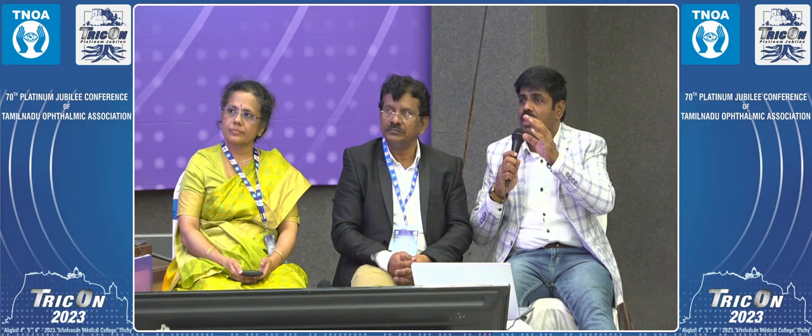Thank you, Professor Dr. Venkatesh. A quick question to you regarding the chopper. I saw that for most of the hard cataracts you were using a much sharper chopper. What is the size of the chopper you prefer for a lower grade, a higher grade, or a Morgagnian?